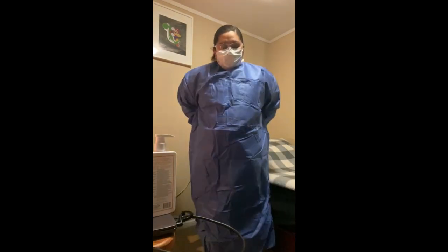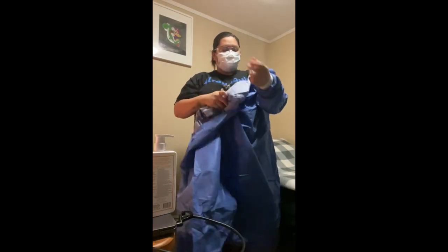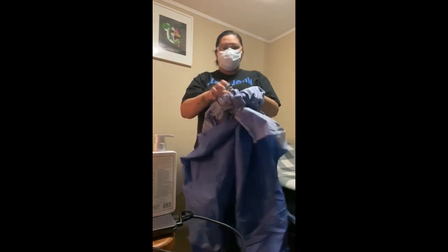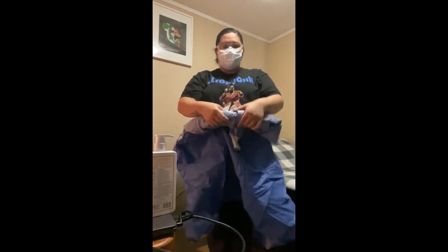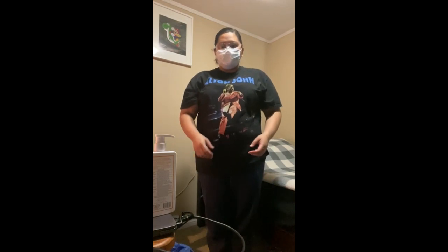Next, remove the gown. Carefully unfasten ties, grasp the outside of the gown at the back of the shoulders, and pull the gown down over the arms. Turn the gown inside out during removal. Put it in a hamper, or if disposable, put it in the garbage. And of course, hand hygiene.